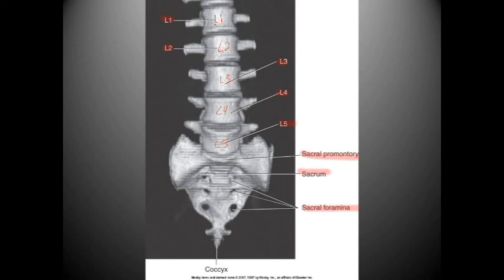A lot of it is based on whether the patient has enough calcium in their bones to actually demonstrate excellent anatomy. Usually this doesn't work so well in older patients because they don't have enough calcium in their body to support doing this, because everything just kind of gets, for lack of a better term, grainy and unappealing in terms of the way the images actually look. You cannot distinguish anything.